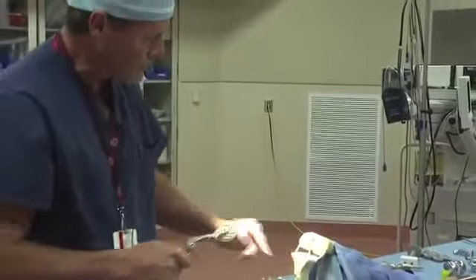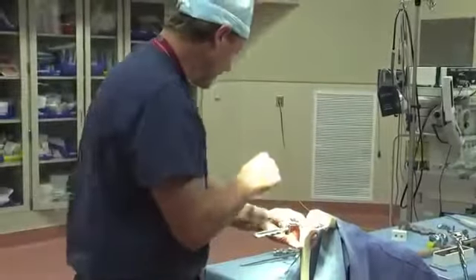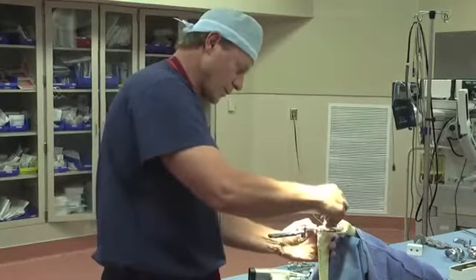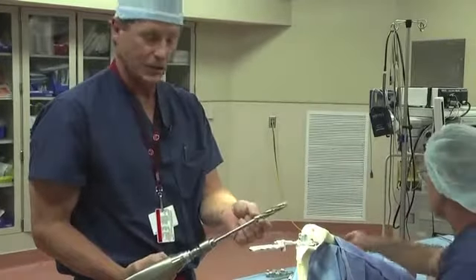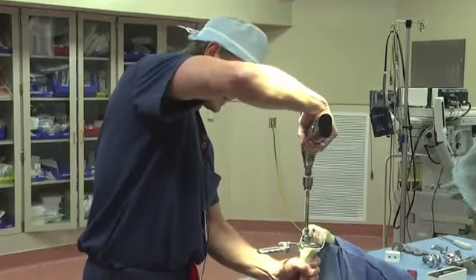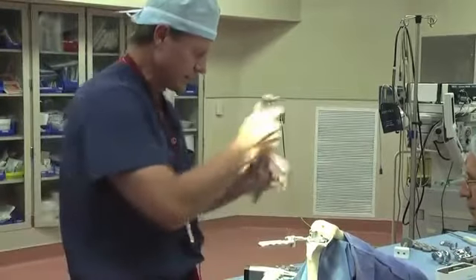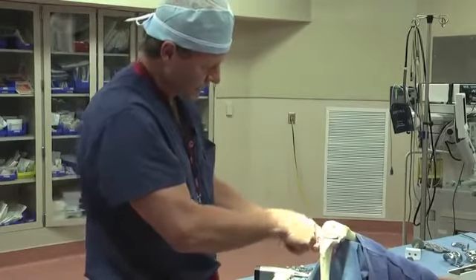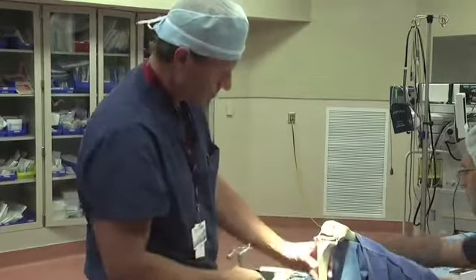Next, similar thing — we want to measure the size of this. We have multiple sizes to mix and match so we get the perfect fit on the patient. The next step will be to pin this in place. We have a little tower that goes onto this, and we'll put this in place. We'll go down to the depth of the indication on this reamer here to make our hole for the stem that goes on this particular component. Then there's a punch with fins that matches up to what we'll put in for our final implant. Once we've prepared the tibia, we'll go ahead and remove this handle and turn our attention back to the femur.